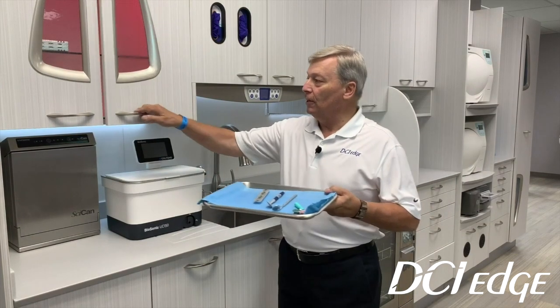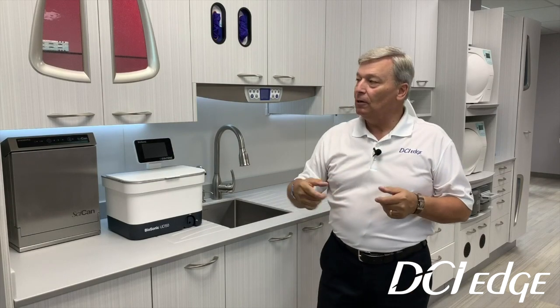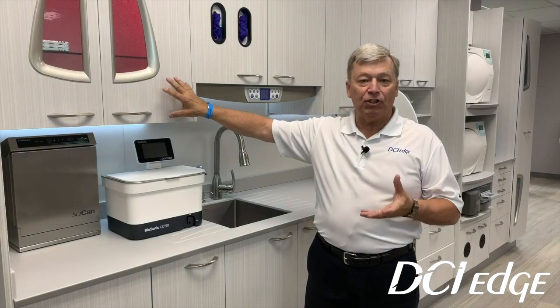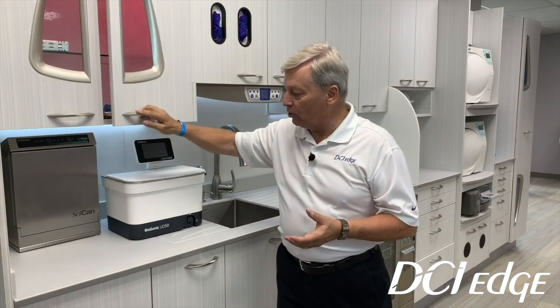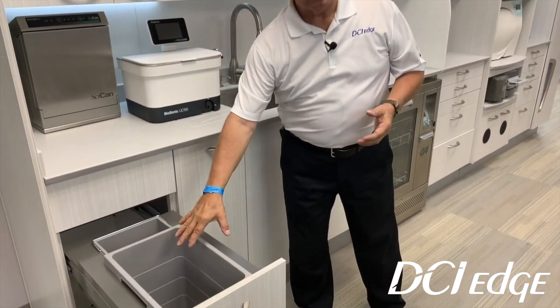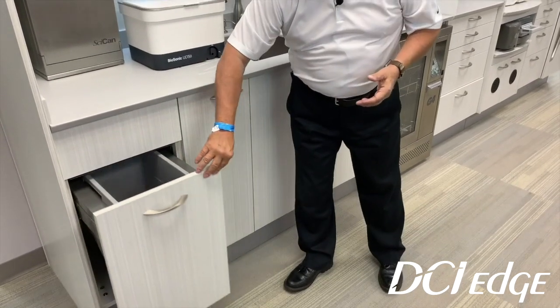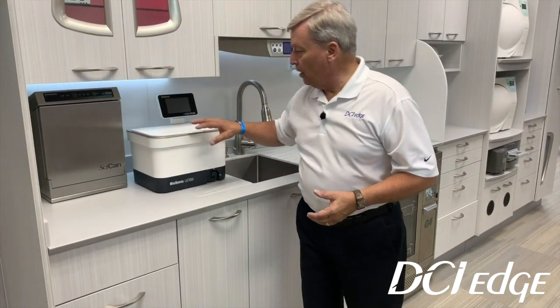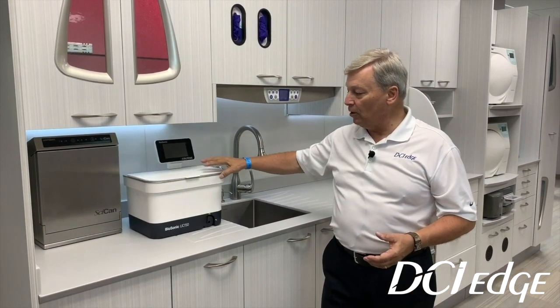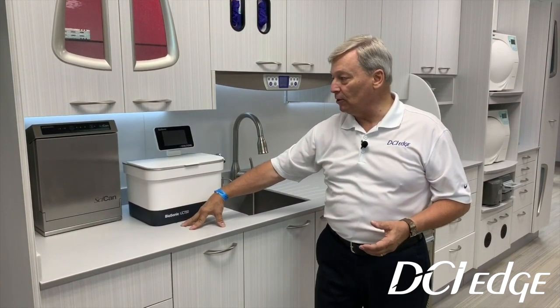What she's doing first is just inserting it into the upper cabinet between each patient. Once the cabinet becomes full or the assistant wants to batch instruments, she then will bring the instrument trays down. The first section is a drawer that has both infectious waste and a sharps container in it. And then the instruments will go into an ultrasonic cleaner. Now the ultrasonic cleaner may be on top or it could be recessed, and both of those are options.